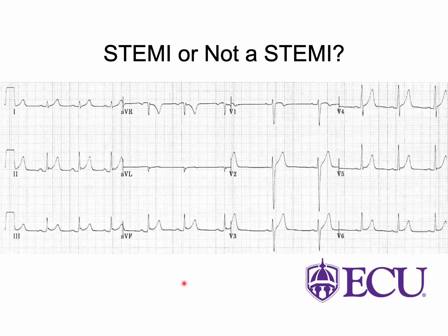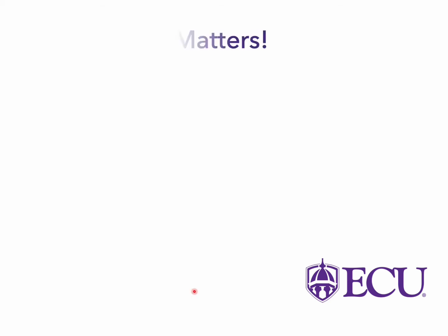Is this a 75-year-old man who's had multiple episodes of coronary artery events in the past, or he's had prior STEMIs and had prior caths, and he's having ripping chest pain and his EKG looks like this? I might be a little bit concerned. If it's an 18-year-old who is calling 911 for shoulder pain, I'm probably less concerned about it. So the key takeaway here is that context matters, right?